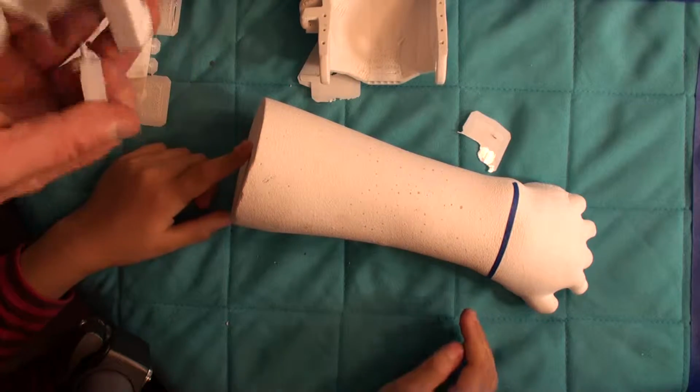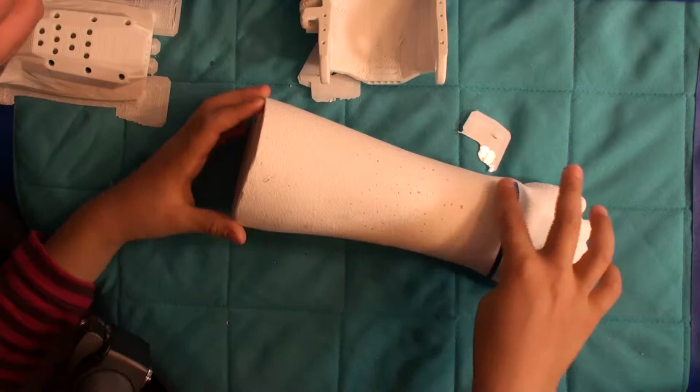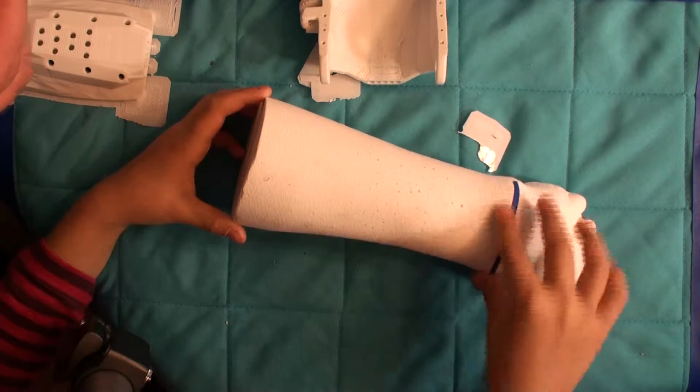Here's my brother's hand. We put some tape on it because this is his wrist.